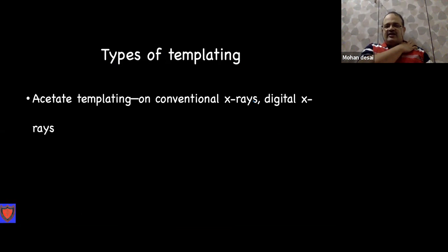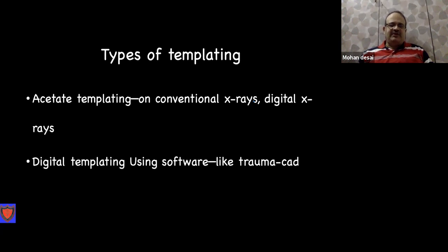The standard or conventional X-rays, these are acetate templating. Then we have digital X-rays, and we lay the plastic templates over it. The third thing is digital templating software, which is available. These are known as TraumaCAD software. This is one of several softwares which are available.